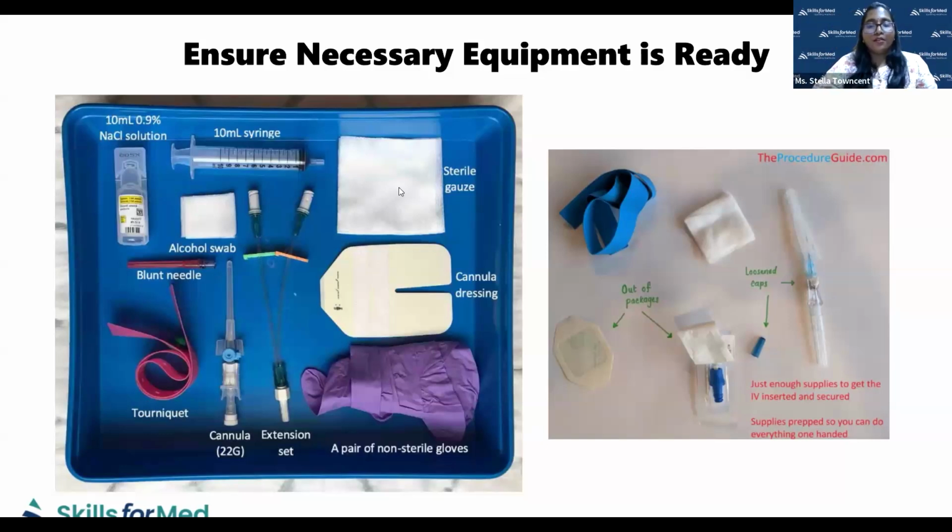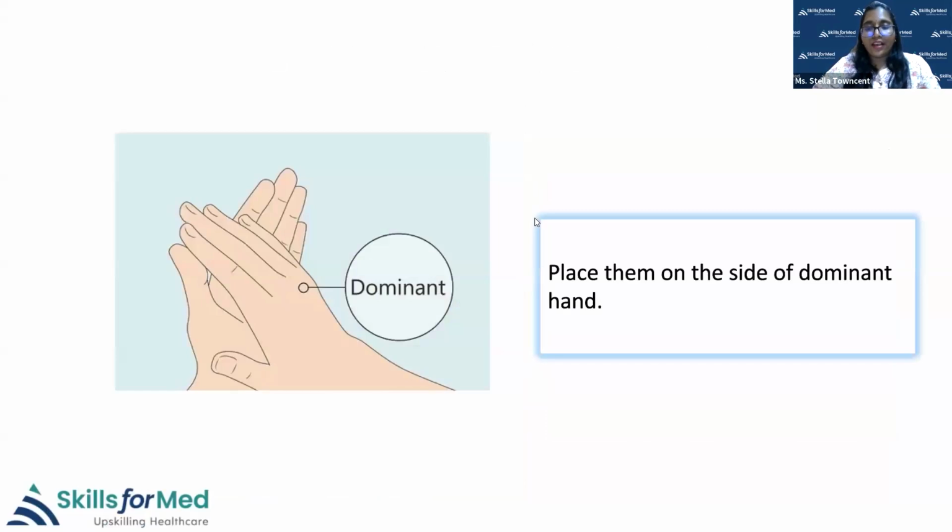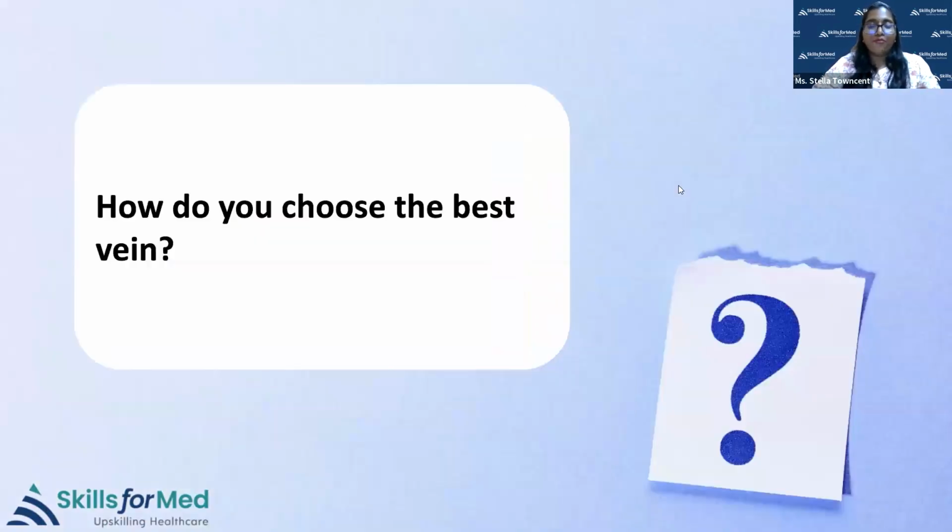Very true, sir. Because as you said, most of them, in a hurry when they set up for the IV cannulation, might fix the trolley wherever it is possible, but that we have to look into, as the dominant side is very important for a person who is going to do the IV cannulation. Here again, it is mentioned, the dominant side. So that would be comfortable for the person who is cannulating also.